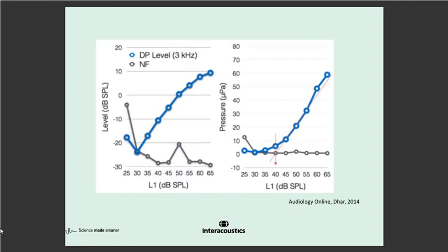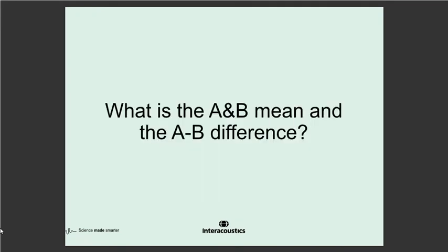And the hope, once again, was that that would provide some kind of audiometric threshold information. Various papers exist to try and evidence that. It is slightly an improvement on other methods, but it still isn't useful at an individual level. So from the point of view of utility in the clinic, I don't know that we've strongly demonstrated clinical utility. It's a very interesting tool, I'm sure of research interest, but I couldn't give you a use-it-for-that message at this stage.